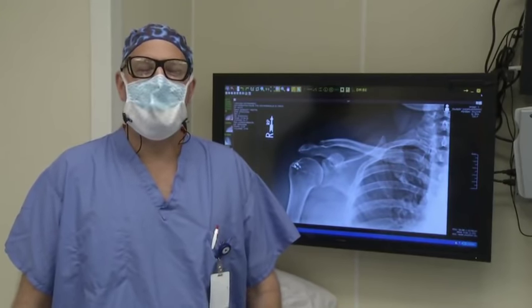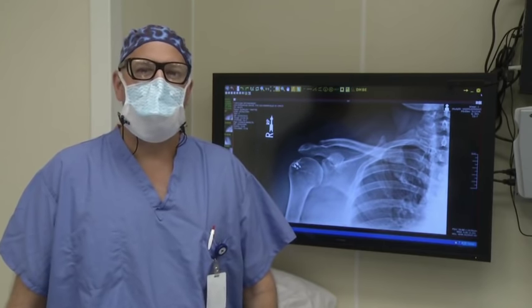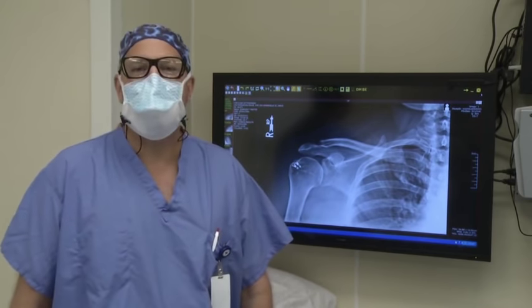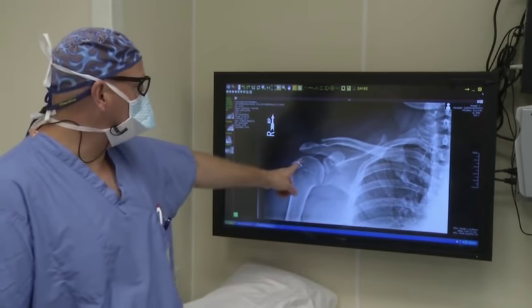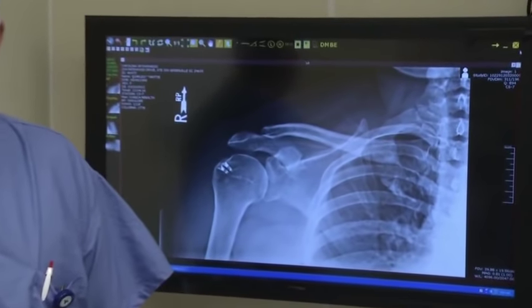My name is Alan G. Posta, Jr., MD, and we are here at the St. Francis Eastside Hospital. We are preparing to perform a shoulder arthroscopy this morning. The patient is a 45-year-old right-hand dominant female who has injured her shoulder at work. As you can see, the patient has undergone a previous rotator cuff repair to the right shoulder elsewhere.